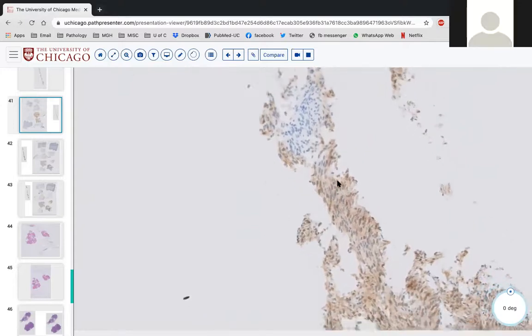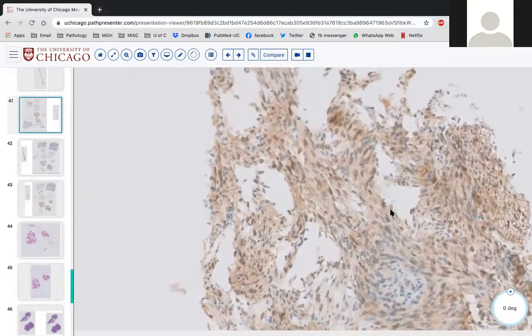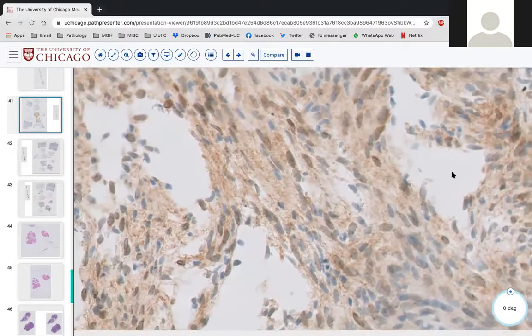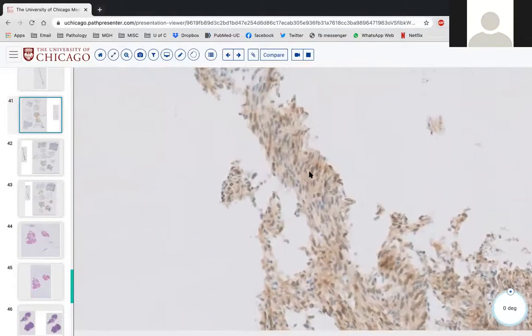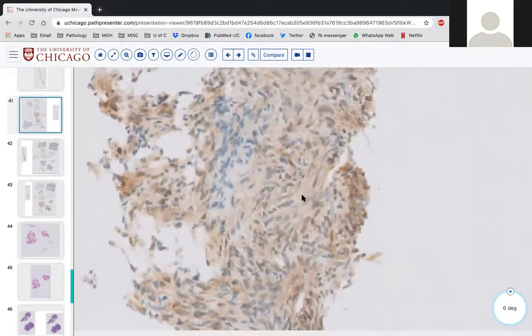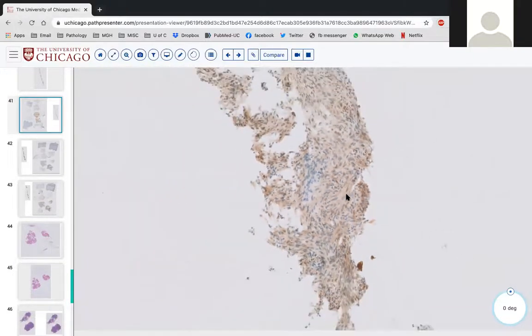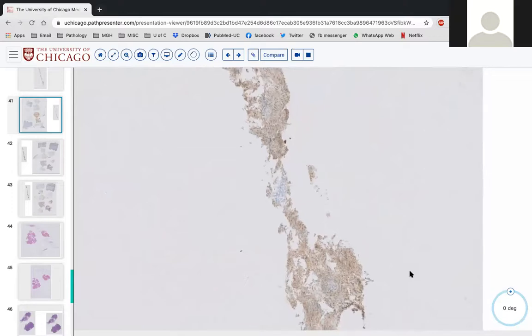Yeah, so we do have a calponin. This case was also very difficult to interpret stains because we can see that it's positive in some areas. So calponin would lead us towards, like Brooke, what you said, some kind of soft tissue, smooth muscle thing, or also positive in what salivary cells, I guess we could say? It would be myoepithelial cells. I don't know the exact term. Yeah, exactly. So what else would you like to see? So that was our calponin.